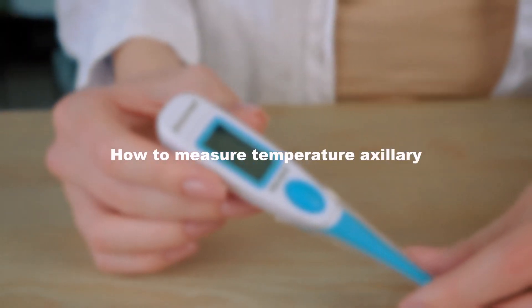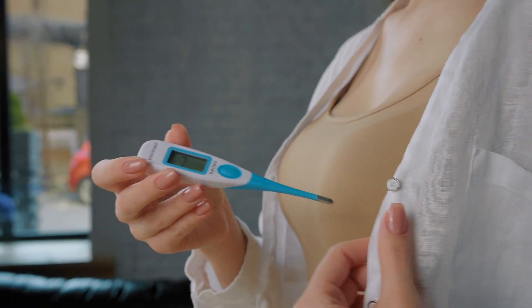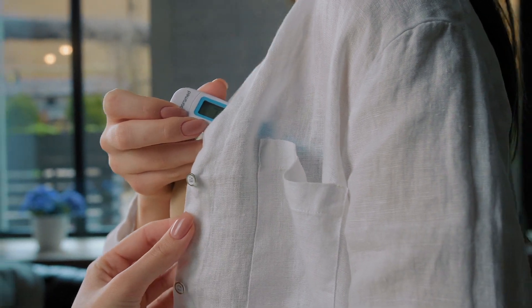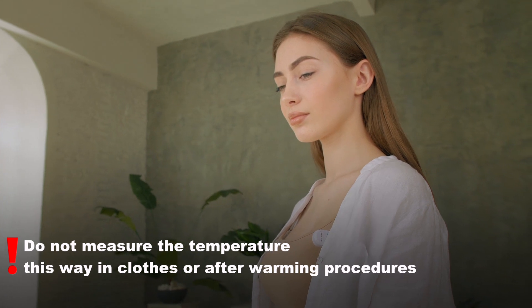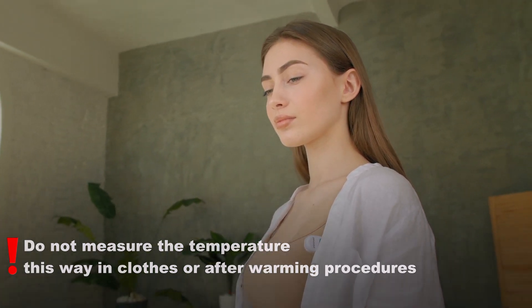How to measure temperature axillary? This is the easiest measuring method. You need to switch on the thermometer, place it under your armpit, and wait for results. During axillary measurement, we advise you to keep the thermometer in place for another minute after the signal in order to allow the device to average the results. Do not measure temperature this way while you are dressed or after a bath or a hot drink.